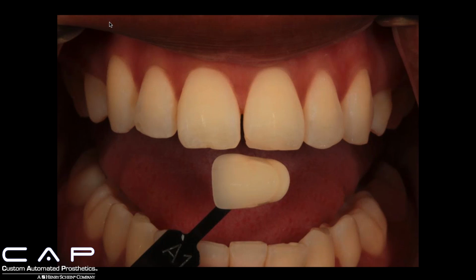So here's the A1 photo with the polarized filters on the lens and on the flash. And right away, I think you can see that there's a lot more going on in Elizabeth's tooth than the specular photo or the standard photo was showing us.